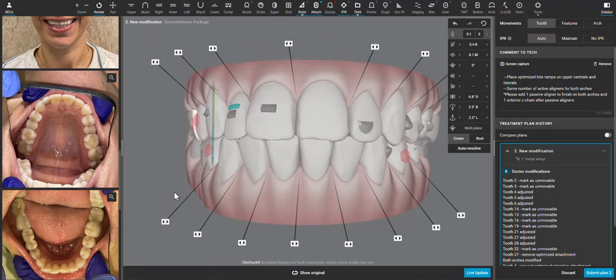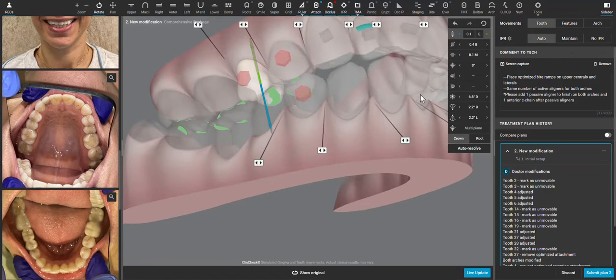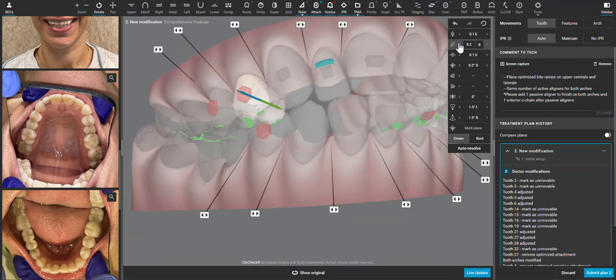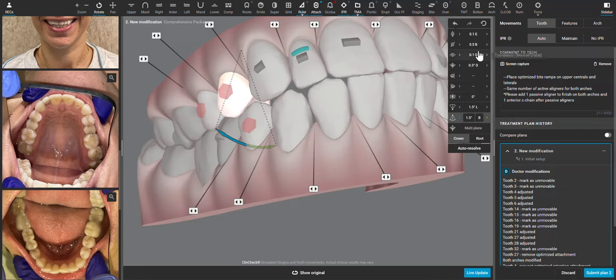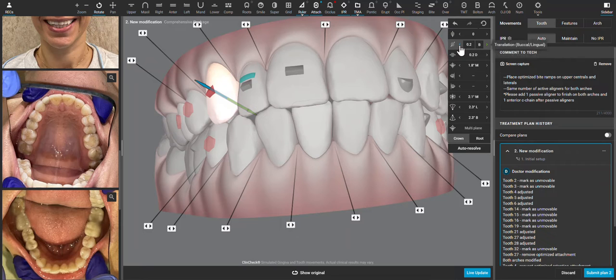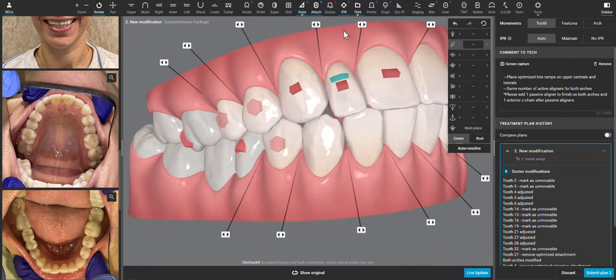I may be limited in how much buccal movement we can do with this second premolar, because it's already occluding fairly well with the bridge on the lower right side. So we're more depending on expansion — if this tooth were in a lingualized position, which fortunately it's not, we would do more crown tipping. Since it is upright, we can do more translation. When we do that, you can see the central starting to come more lingual, and that's not what we need. We just need to create space.